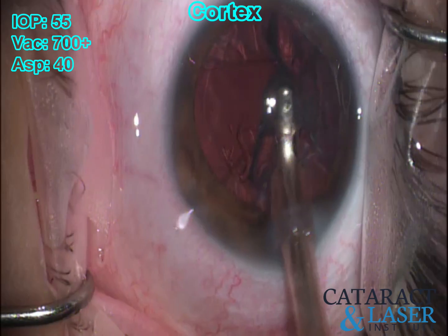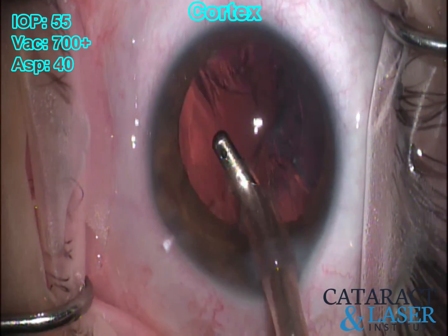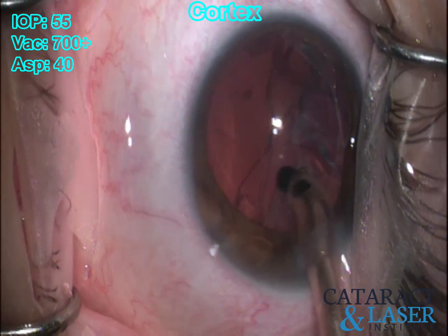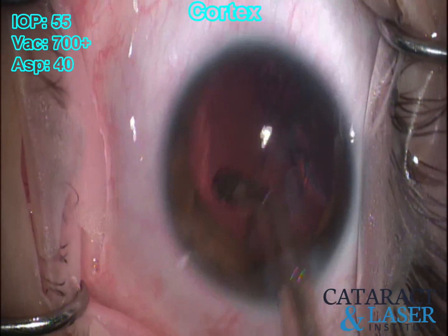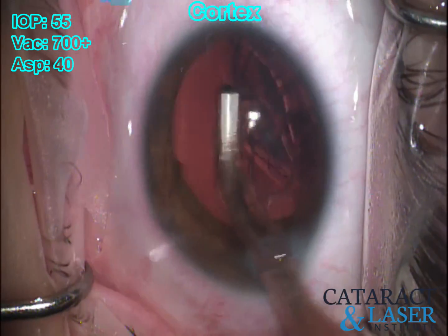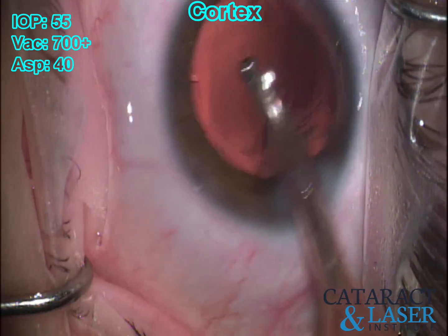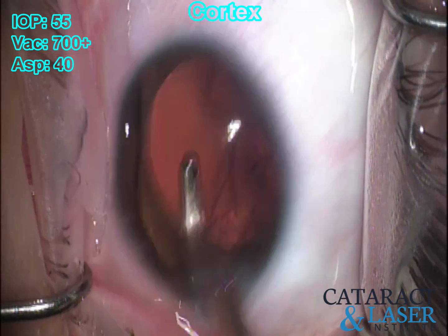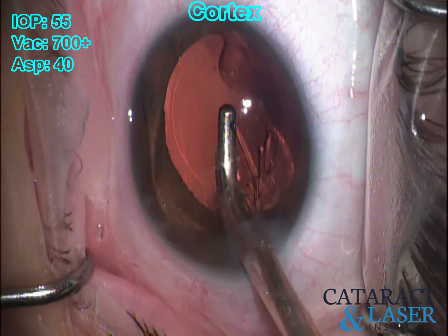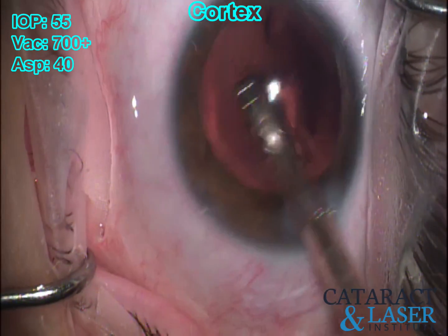You can see there's a moderate amount of epinucleus, but not a ton, and with that little movement right there we got the majority of it out. Just slowly taking our time to remove all this cortex. Keep in mind this is a younger patient — you don't want to leave anything behind because it's just going to be magnified over time. I like to work everywhere but sub-incisional first; by doing everywhere else first and then moving to the sub-incisional cortex, it softens and loosens things up, making it easier to remove. I leave that for last, hoping it's already been released — and there, nicely, it's all come out.